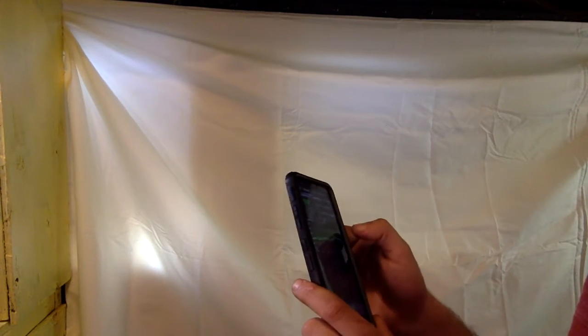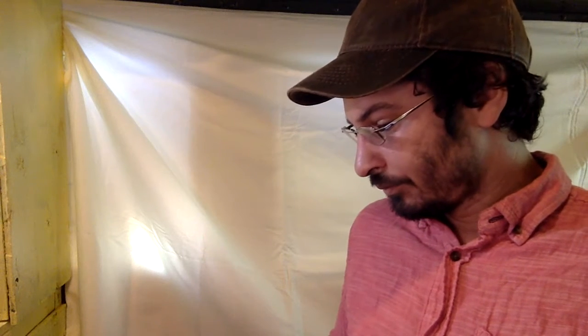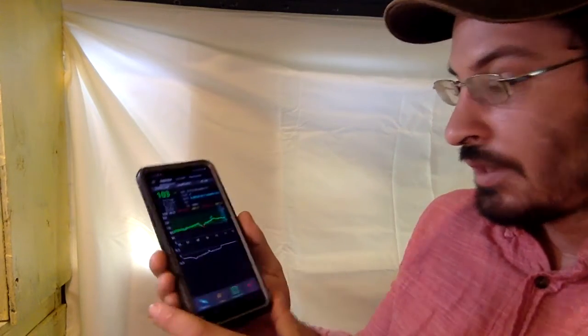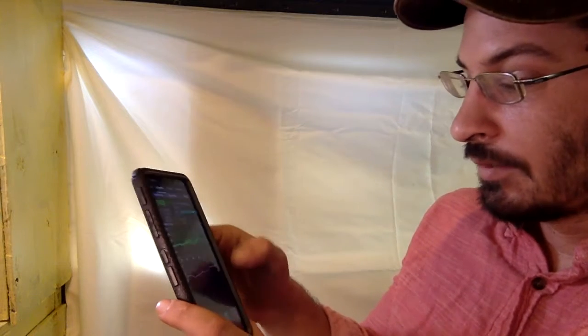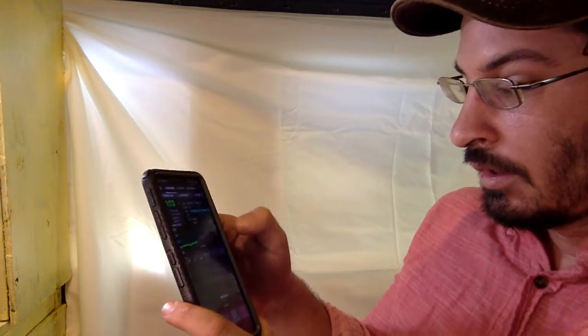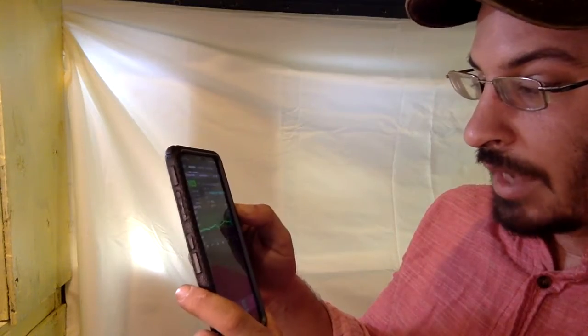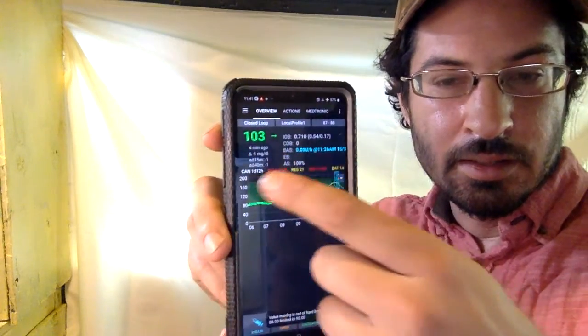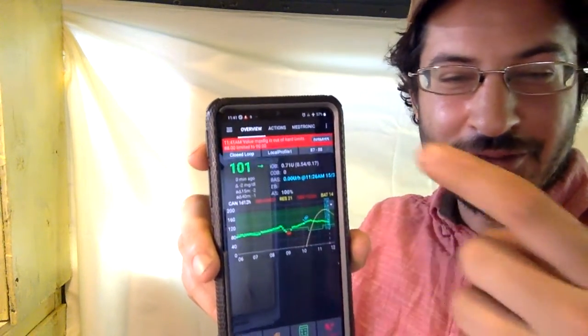The system made me go low because the insulin, the setting at that time, had more of an impact than the system expected. So if you're seeing green all the time, maybe that would be like your insulin to carb ratio is wrong. Basically, you want to look at your insulin to carb ratio, something like that. So sensitivity, I don't know that much about interpreting the sensitivity graph, so I'm going to reserve comments. So this is activity here. You see it notes where I put in 1 unit, and then the activity goes up from there.